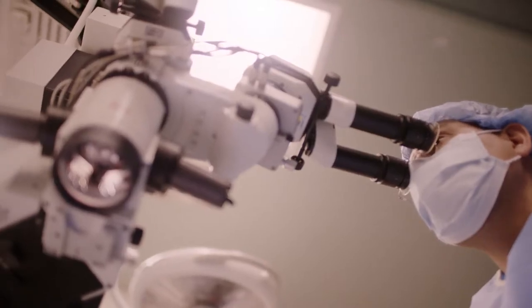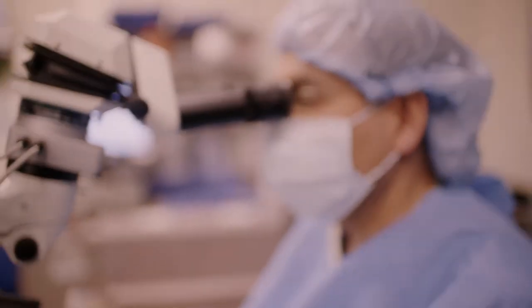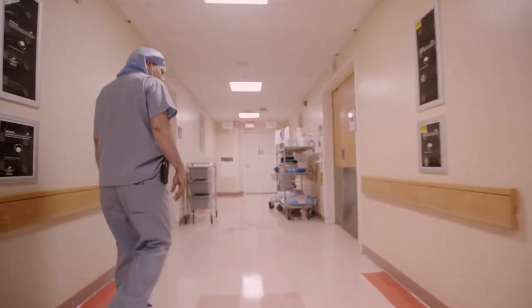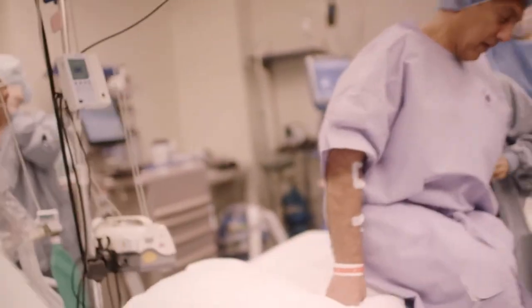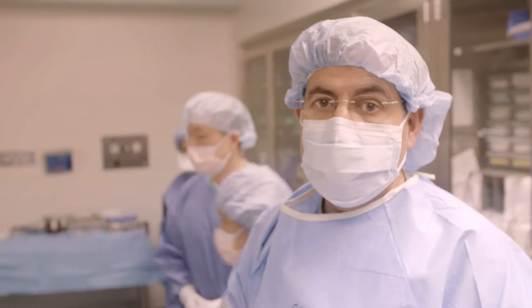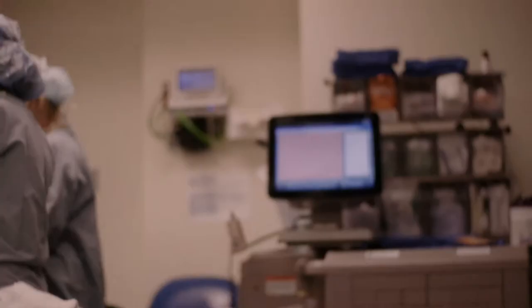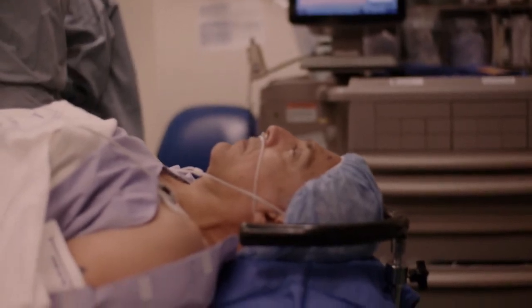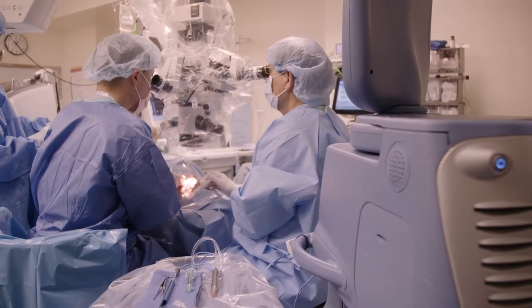When you start to do eye surgery, because it's such a delicate organ and it's microscopic surgery, it seems very difficult. But as time passes, it becomes second nature. So now we are cleaning around the eye. This is a prevention of infection, a procedure we call prepping the eye. The first one, we're gonna make the side port incision, basically give all access.